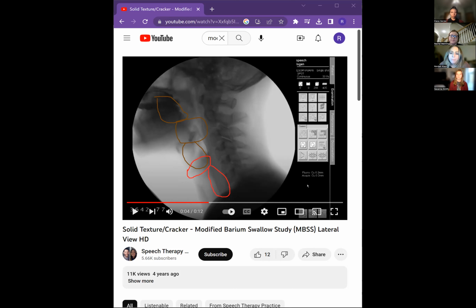Okay. And so from these images, can you give me a diagnosis? So what we'll do is I'm going to take the time to look over this with the radiologist and your doctor that ordered this study. And once we review it all together, we'll be able to give you a diagnosis. Okay, that sounds like a plan. Thank you.